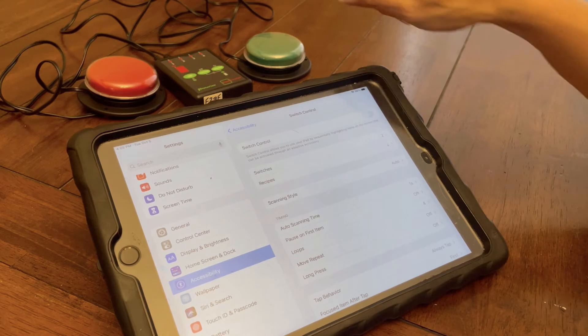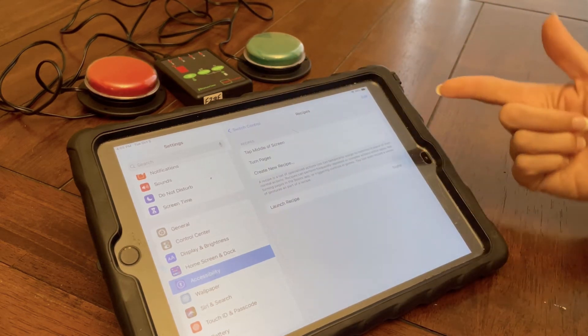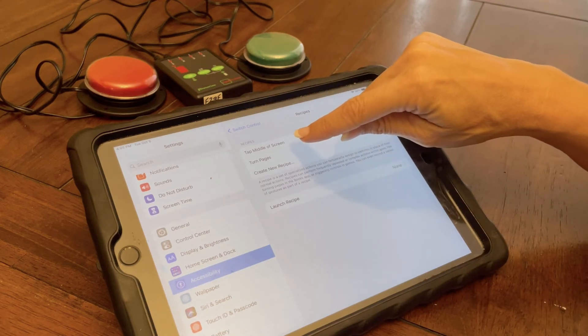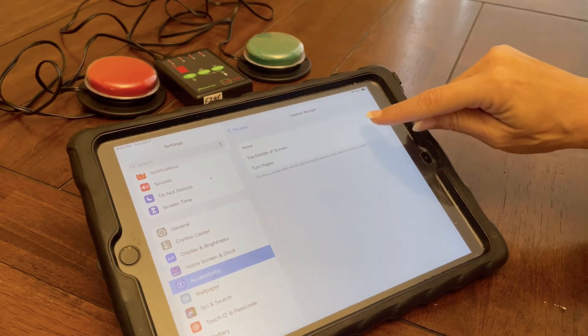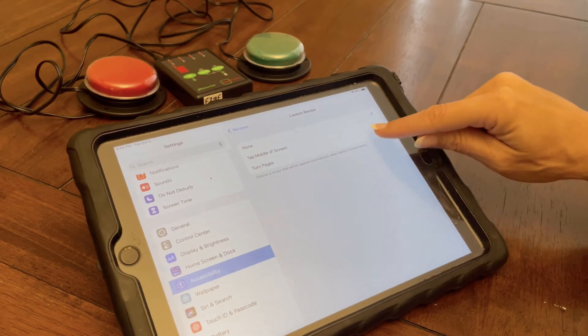That's how I set up my switches. Those switches are going to do whatever I have set them to unless I have a recipe set up. A recipe means that I can have something pre-programmed, like tapping to the middle of the screen or turning a page. So if I want to launch a recipe, I could launch a recipe to turn the page, for example.